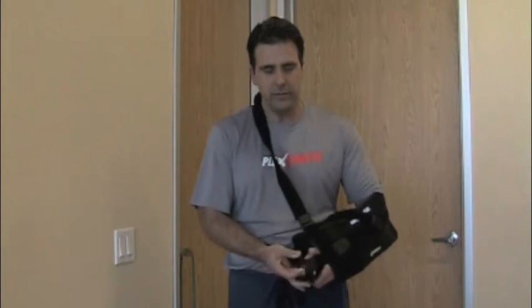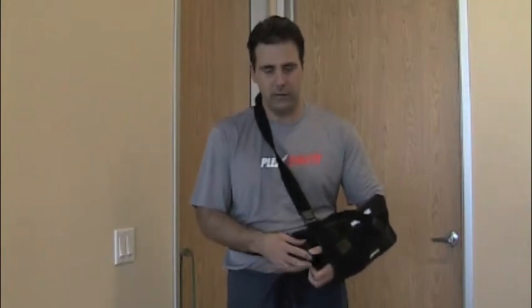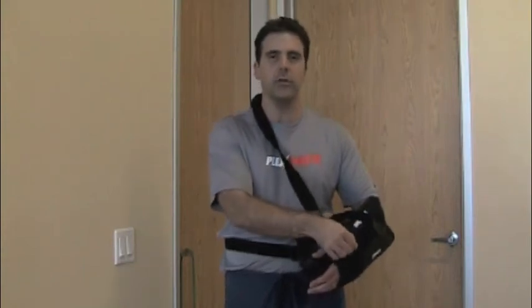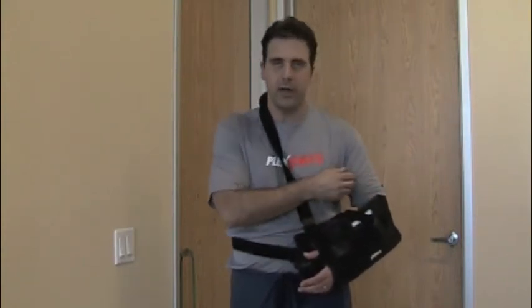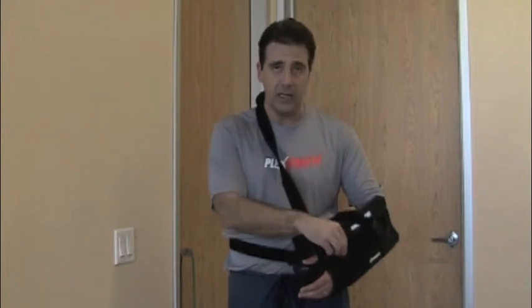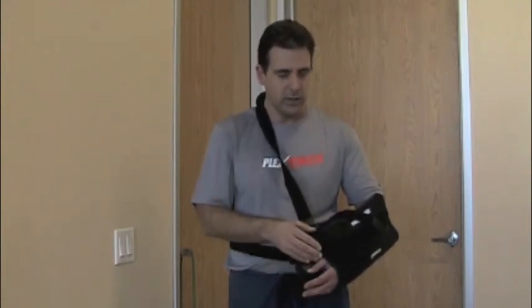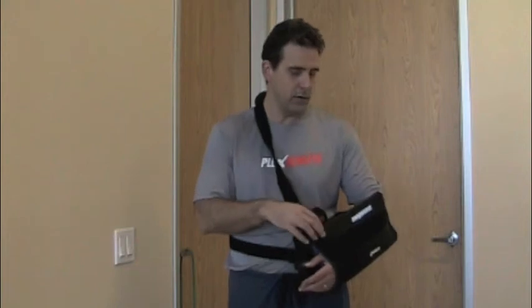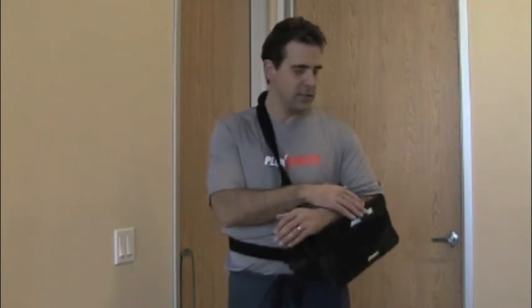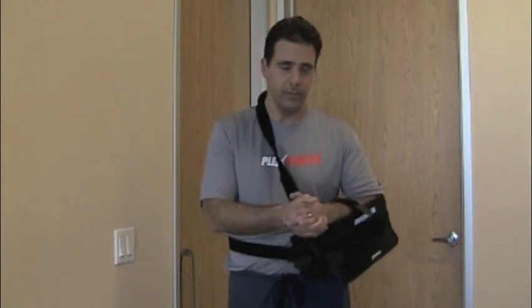Depending on what kind of surgery you've had done in the shoulder, whether or not the type of tear, the rotator cuff, or whether or not the biceps was involved, will determine whether or not you can actually fire your biceps, because a lot of times this biceps tendon has been repaired and you don't want to fire the biceps. But if you can, and you're allowed to by your surgeon, you can unstrap your sling and just gently move your elbow. Okay? You're still keeping your pillow by your side, using it to support the elbow, but you can do some passive motion exercises with the elbow.